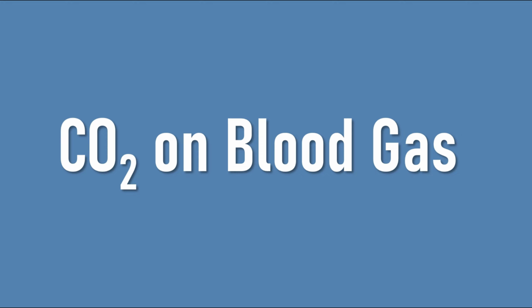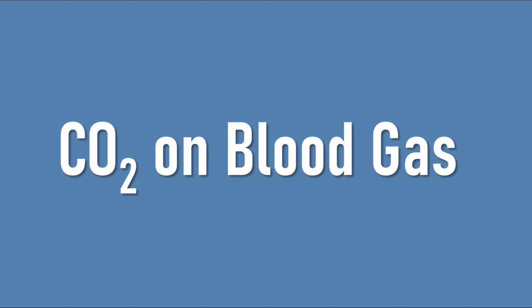One of the major goals of physiology is to control the carbon dioxide tension in extracellular fluid and the hydrogen ion activity within that space. Carbon dioxide is measured directly and accurately from arterial and venous blood using a blood gas machine. A blood sample is taken, it's injected into the machine, and the CO2 diffuses out of the blood and into the measurement device. The blood gas machine then uses the partial pressure of CO2 that it measures and the pH of the blood that it also measures to calculate the bicarbonate using the infamous Henderson-Hasselbalch equation.